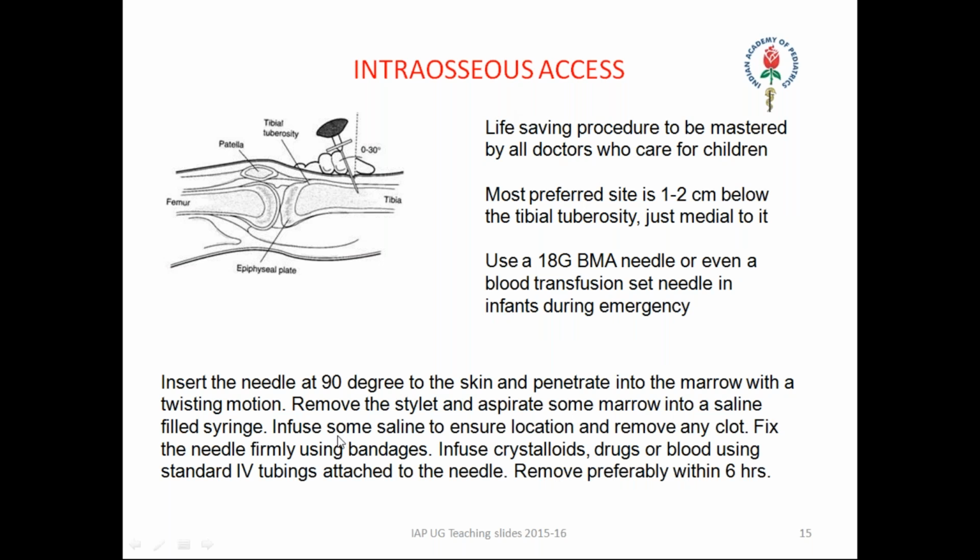So coming to the intraosseous access, it is a life-saving procedure to be mastered by all the doctors who care for children. If a child is presented to a casualty in shock and you don't get an IV cannula, nowadays don't wait for an IV access. Go with an intraosseous access, because it is a life-saving procedure. Even the shock can be treated, which prevents cardiorespiratory failure.